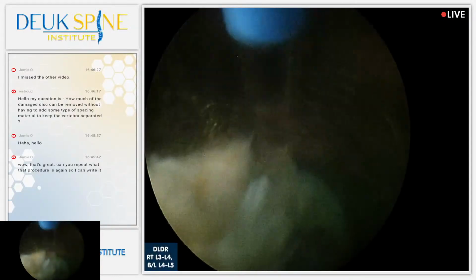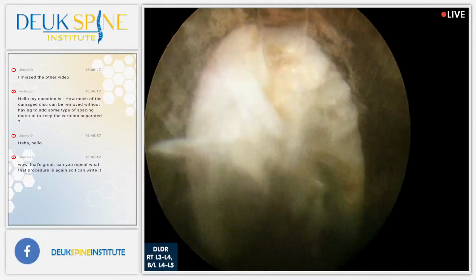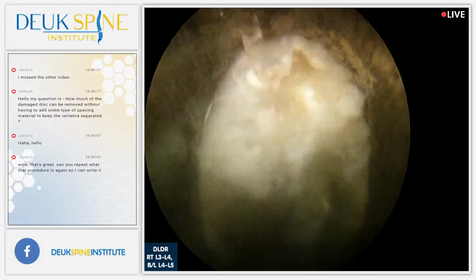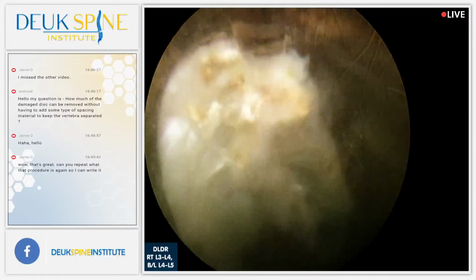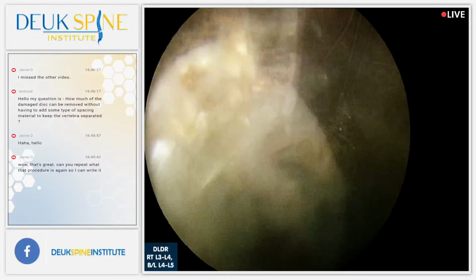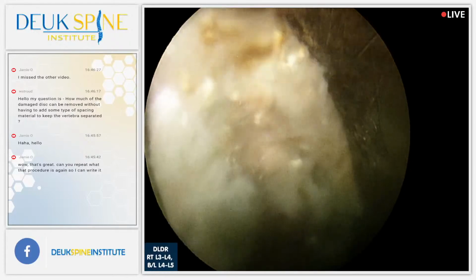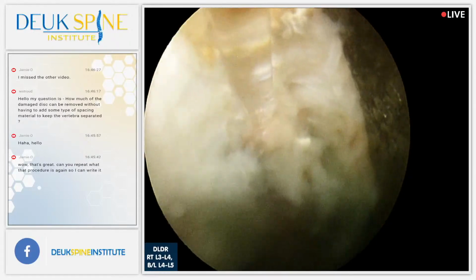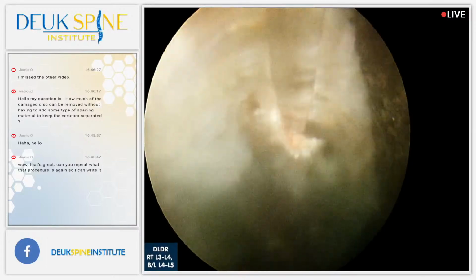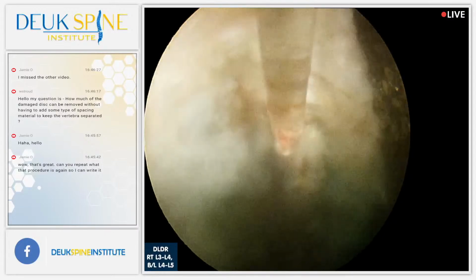All right, Jamie, hopefully you see from this video we just played that we're bringing the laser in to the tear in the back of the disc where the herniation is, and we're literally using the laser to clean out the tear. That's what you're seeing right now, the white thing. See all those little fibers right there? Those little white strands going around there, right there, underneath the glass? Those are annulus fibrosus fibers, and they're collagen.